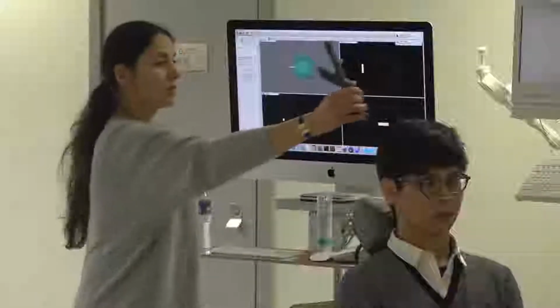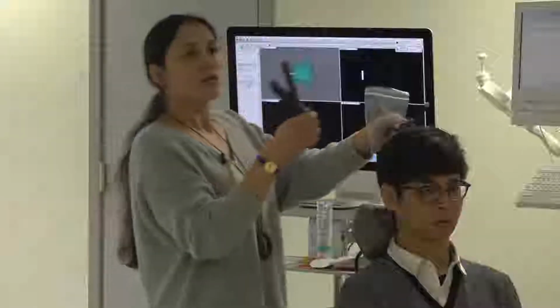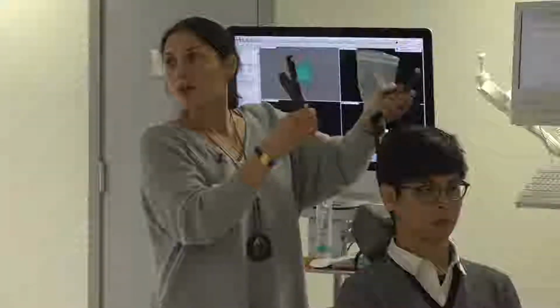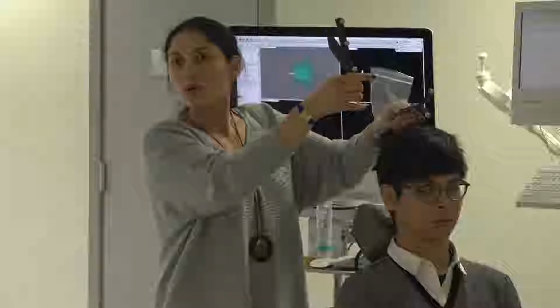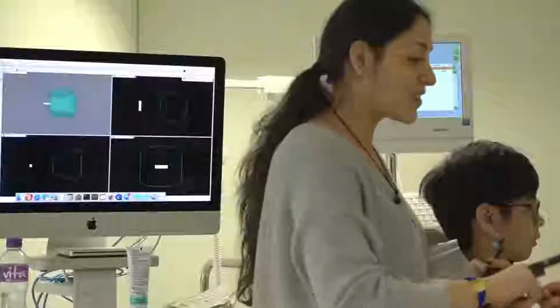You see the dot there? Yeah. So it should be in view, and all the other sensors should also be in view. If not, sorry, Joseph. So you really want to check that the camera can see it. It is silly now, but as you can see, thank you very much.